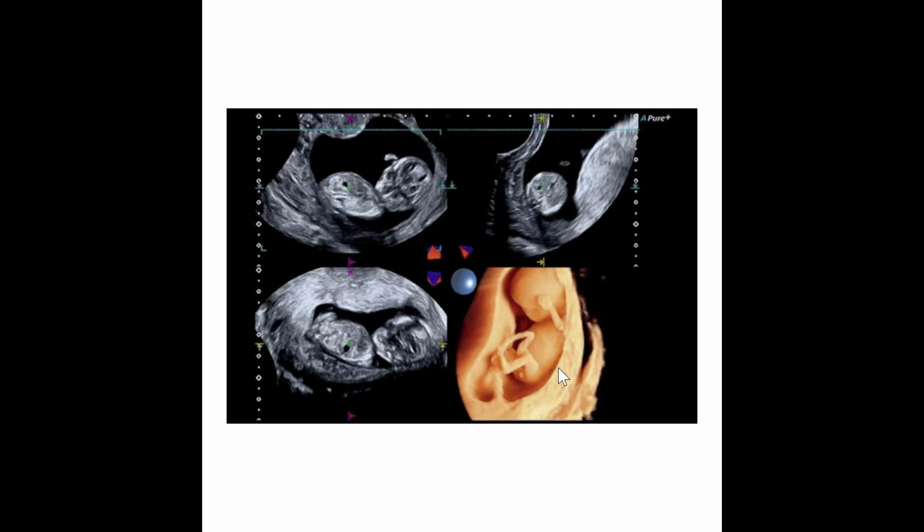So here we can see what appears to probably be about a 12-week fetus in 3D. We can see the uterine wall, we can see the cord attached to the uterine wall, we have a little foot and a leg, genitals here, arm and a hand up by the head. So it makes sense why a lot of parents enjoy getting the 3D fetal ultrasounds, because it makes it feel very real. It's easier to see. It feels like you're actually looking at a baby instead of this black and white skeletal appearing structure.